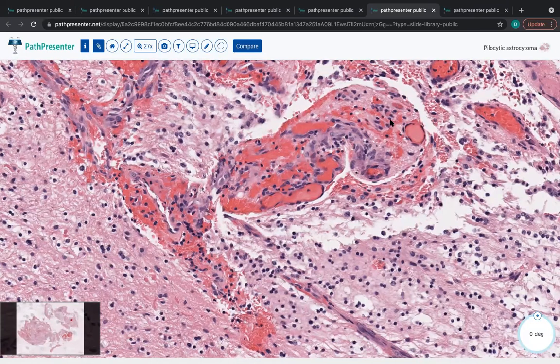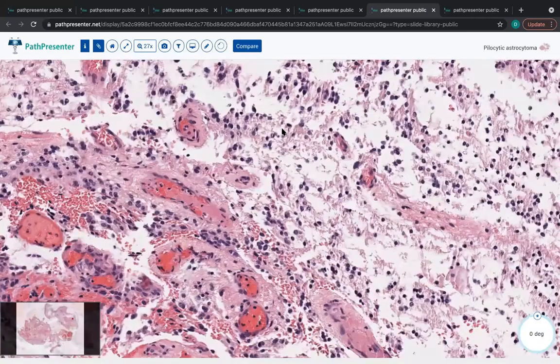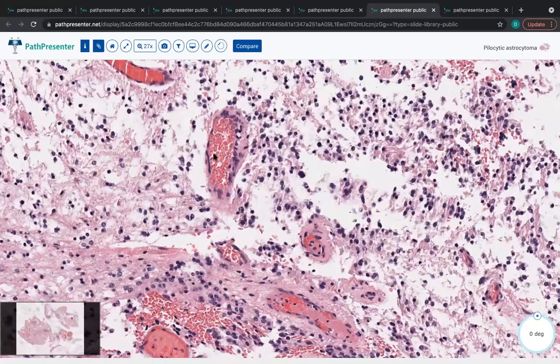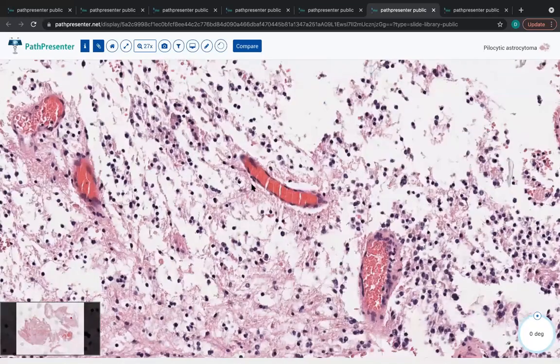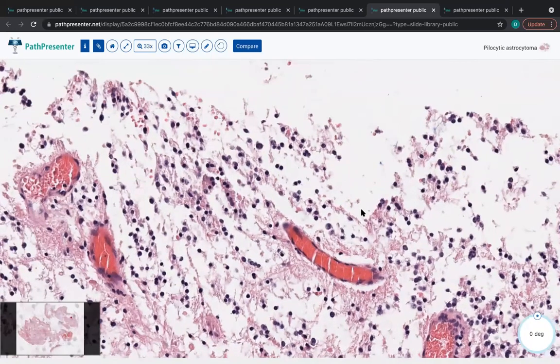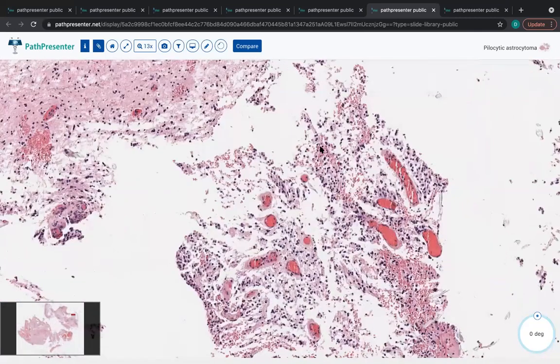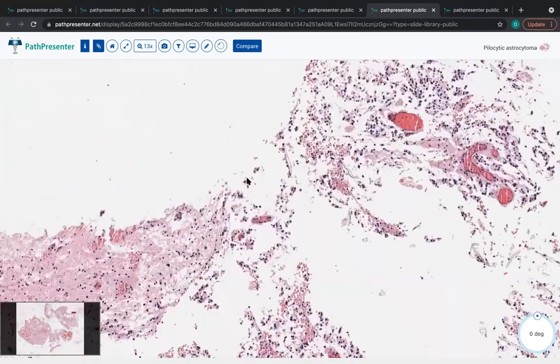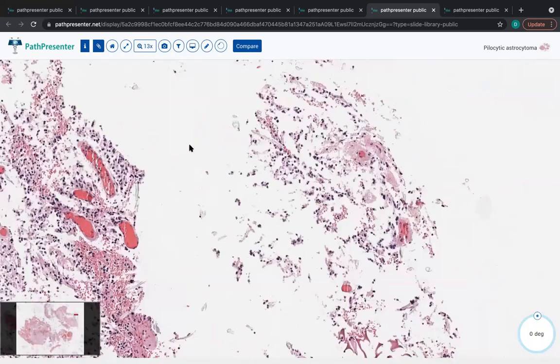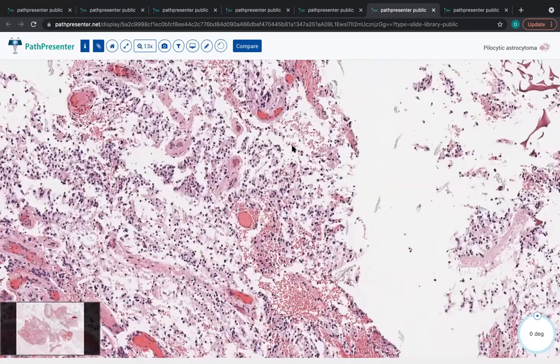So as a result, it's probably a good idea to hold off on calling a tumor a pilocytic astrocytoma if it doesn't fall really well within the very characteristic clinical pathologic presentation. We will tend not to call pilocytic astrocytomas if they're outside the cerebellum. Many of those tumors have different molecular drivers that lead to different prognoses, but have somewhat overlapping histology.